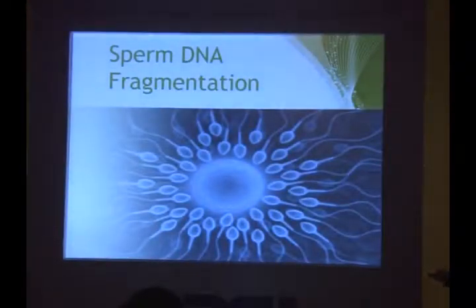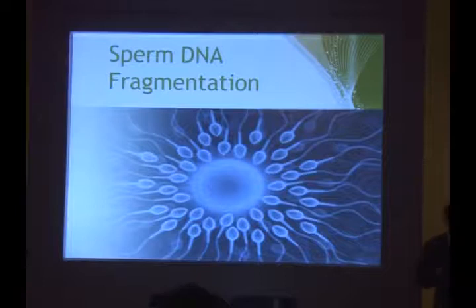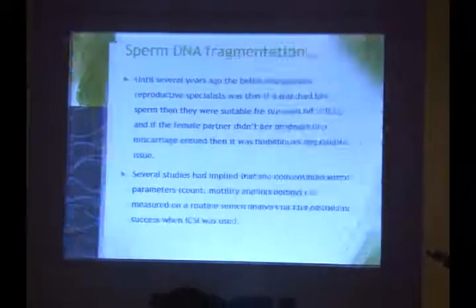Then we come to the sperm DNA fragmentation test. If semen count and motility are normal and the patient is not conceiving, then you need to know the fertilizing ability, so you require sperm function assays, and one such assay is sperm DNA fragmentation.